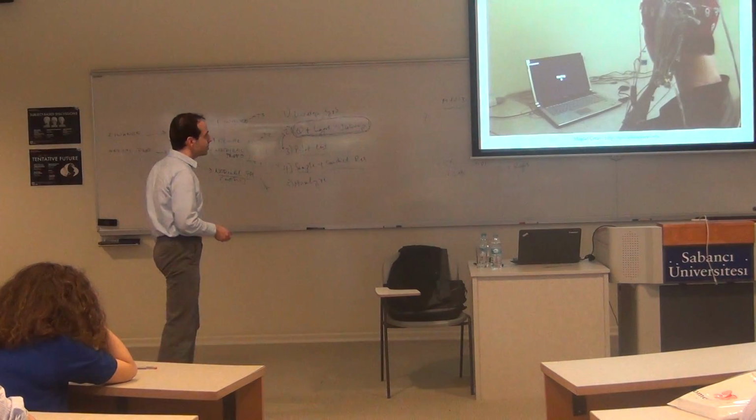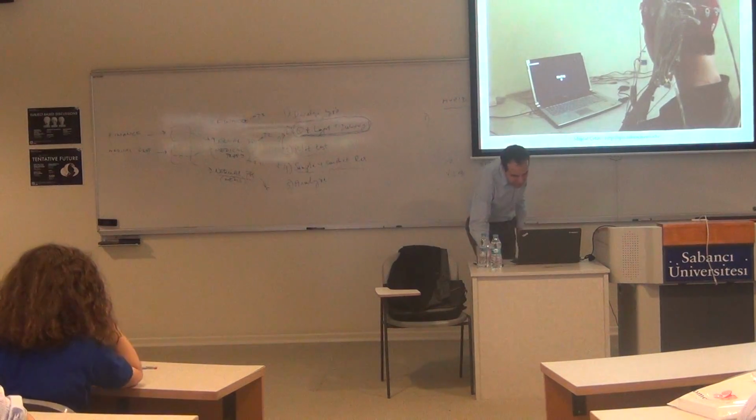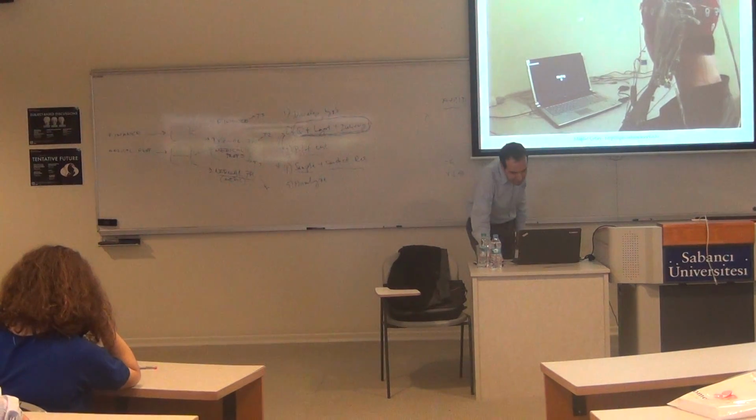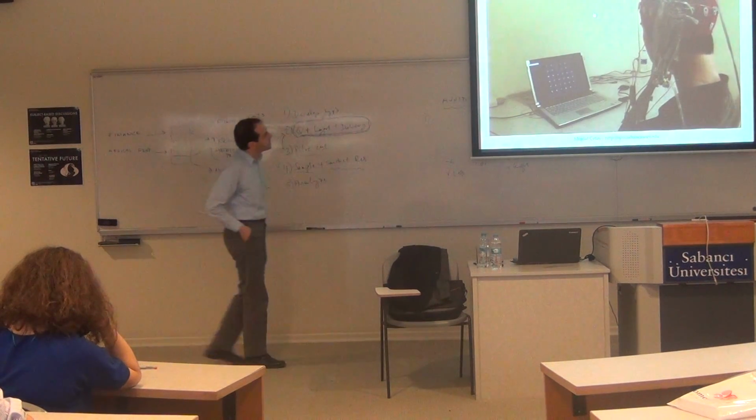And that's a video of our more recent language model-based interface. In this case, the person is typing kulak, K-U-L-A-K. And then moving on to the next letter.